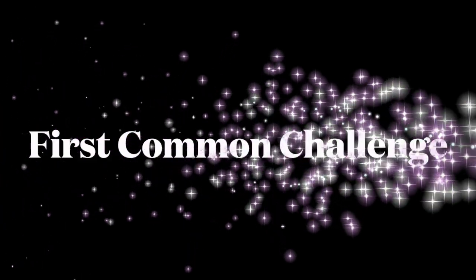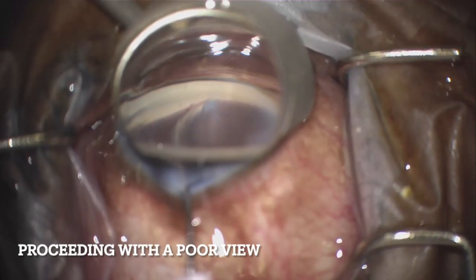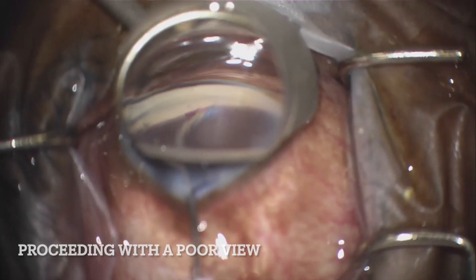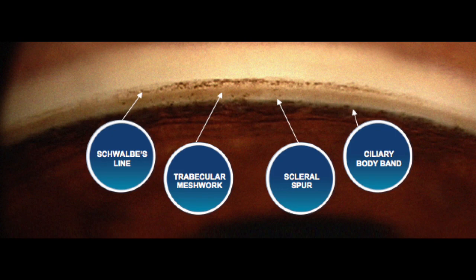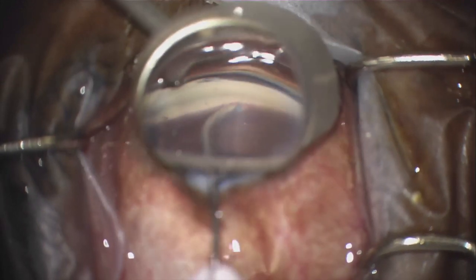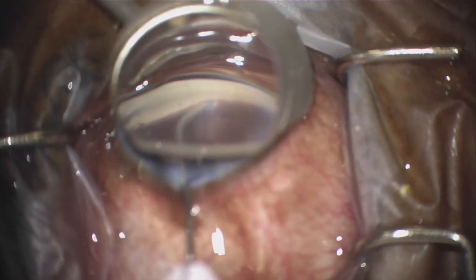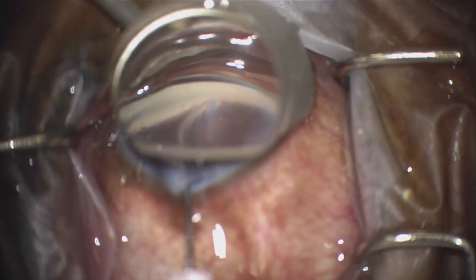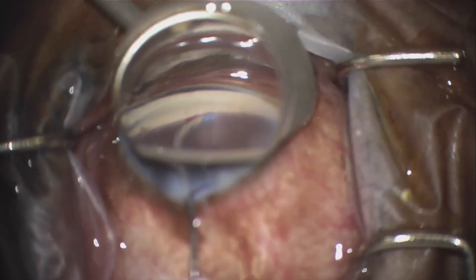One of the most common challenges seen with this procedure, and really any MIG surgery, is proceeding with poor visualization during surgery. Angle surgery is all about being able to obtain a good view. Corneal striae, created from too much pressure of the gonio prism on the surface, can make the initial tip insertion behind the TM or the tracking of the catheter difficult to see.